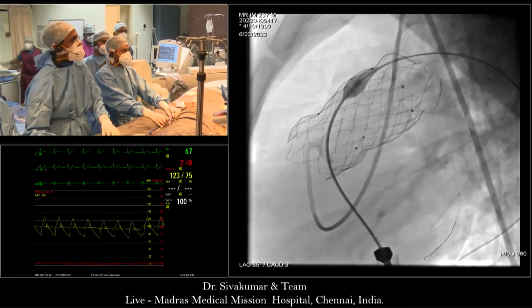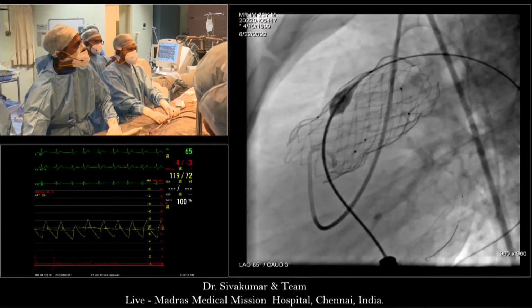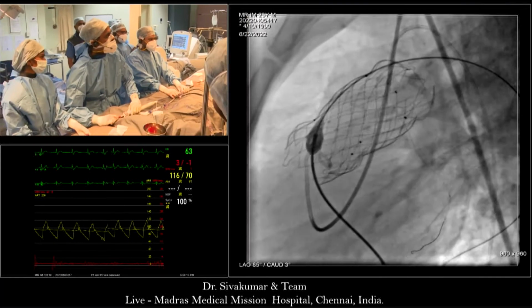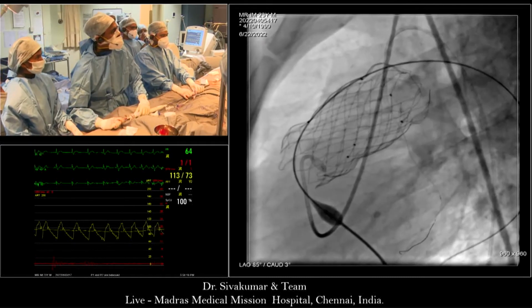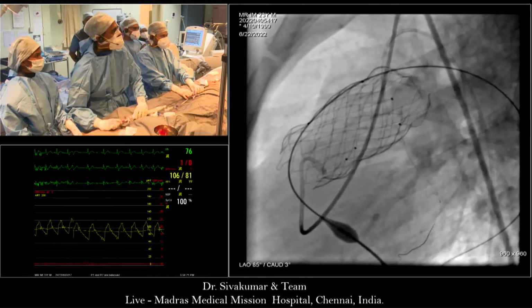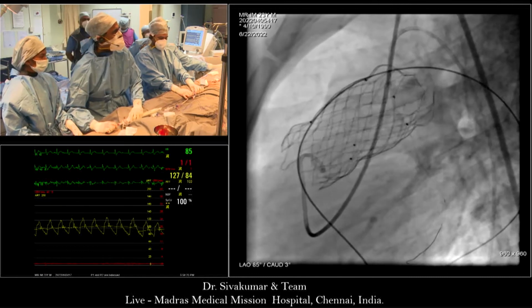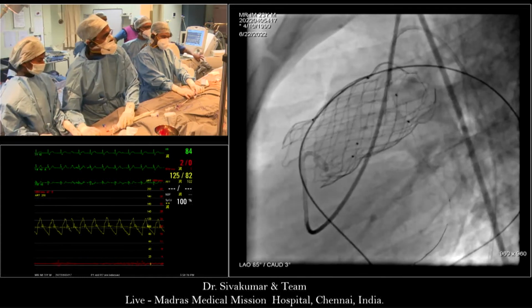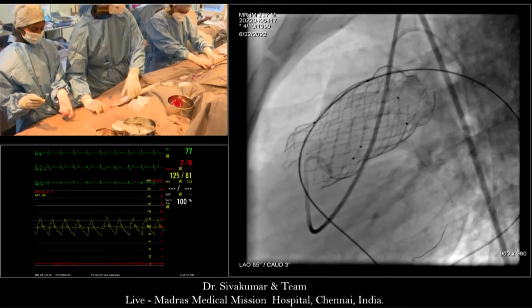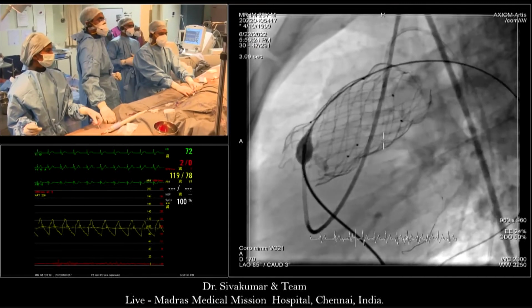Shaq, it's come through anyway now. But what you could do whilst you're there is, never mind. Shaq, I tend to pull the wire, and that drops it down from the distal flare. Yeah. You mean release the tension of the system? That's enough to get it free. Yeah. And also pigtail. Okay. Now get ready for angiogram. 20 ml at 15 rate.